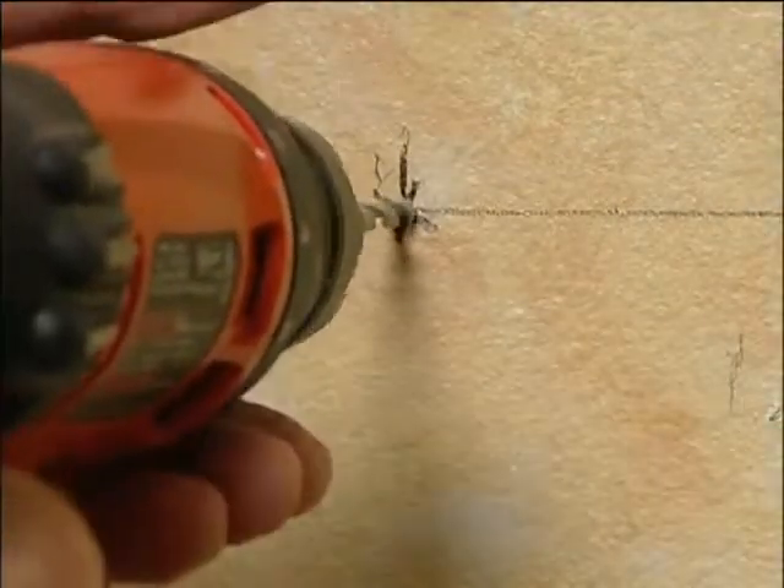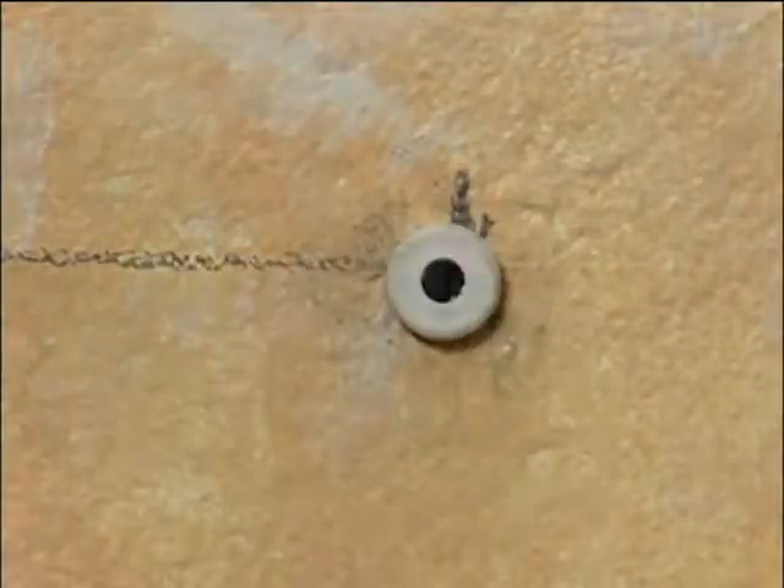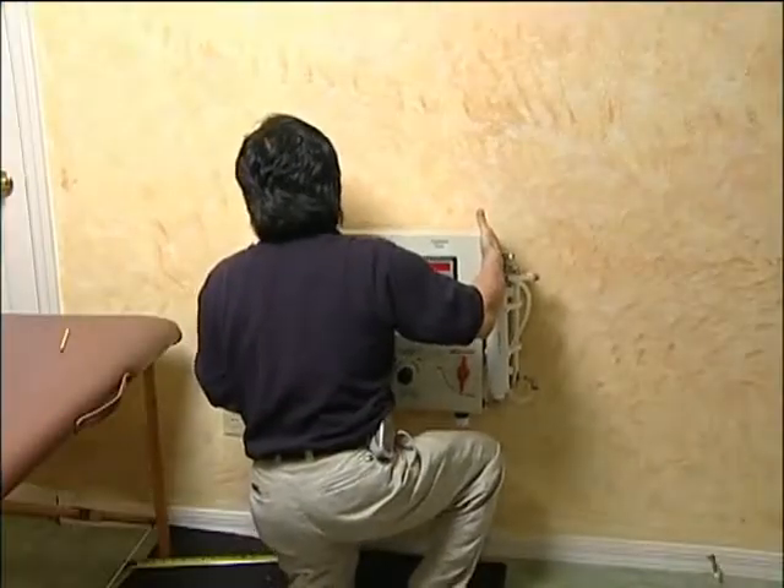Depending on the type of wall material, we suggest you pre-drill pilot holes and use toggle bolts or expansion screws if studs can't be found. With the mounting bolts or screws in place, secure the instrument to the wall.